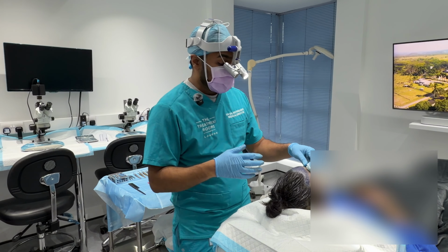So some patients do have these very strong flows to their hairline and to the rest of their crown and spiral and the back of the head as well. But when we're recreating the hairline, we really must observe those natural flows for the most natural looking results. And you'll see that when we're doing these incisions, we're not just following the flows, but we're ensuring that we prioritize the right hairs to the right area.